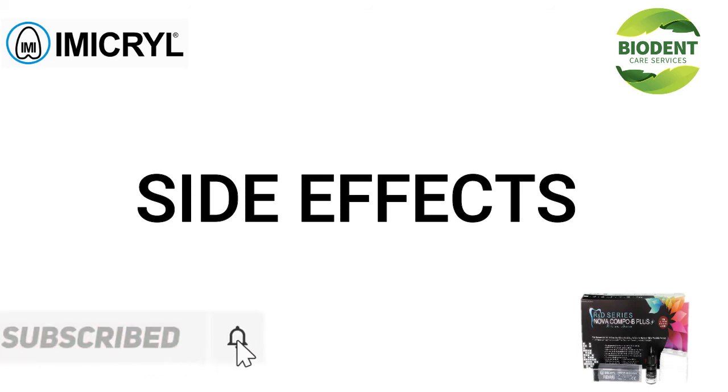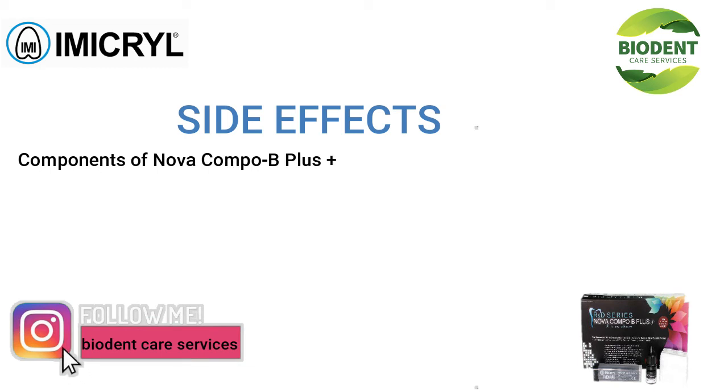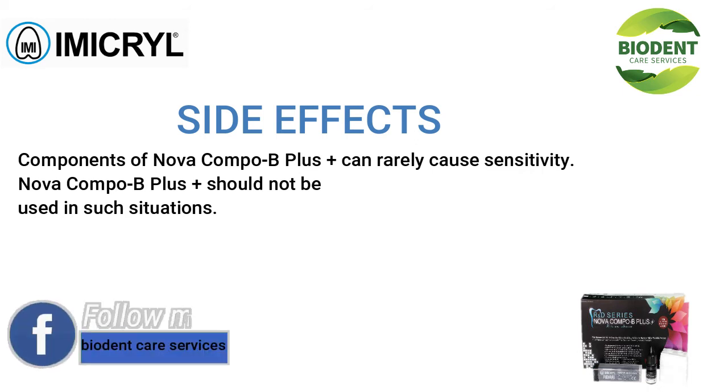Side effects: components of Nova Compo B+ can rarely cause sensitivity. Nova Compo B+ should not be used in such situations.